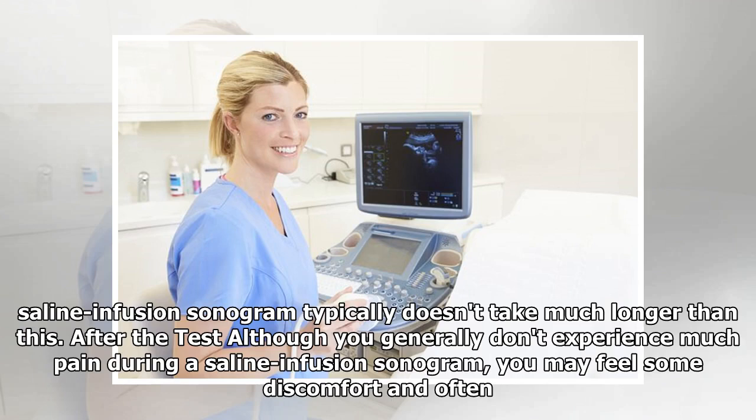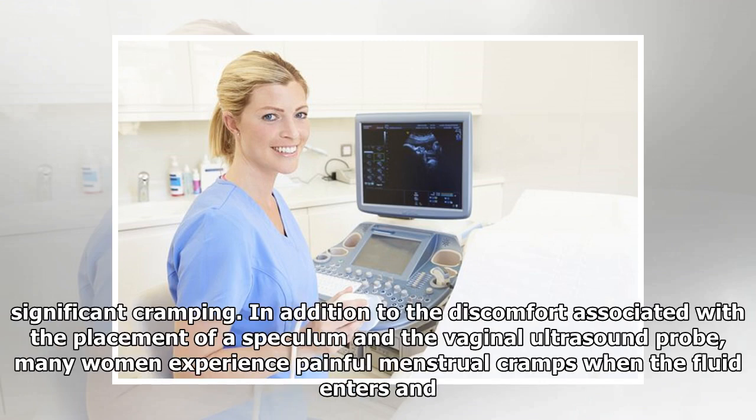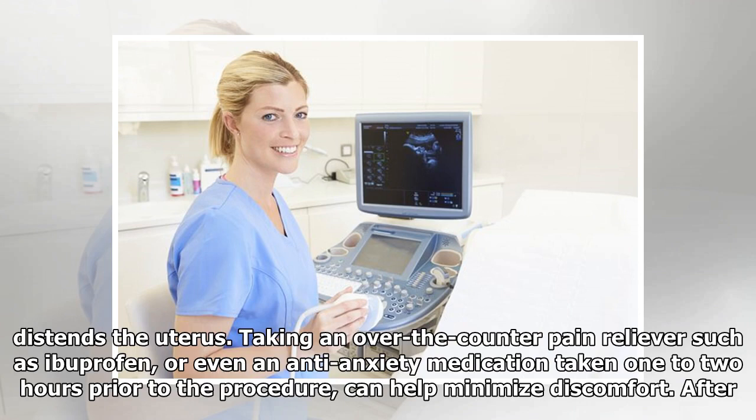Most transvaginal ultrasound exams take less than 10 minutes to perform. A saline infusion sonogram typically doesn't take much longer than this. After the test, although you generally don't experience much pain during a saline infusion sonogram, you may feel some discomfort and often significant cramping.